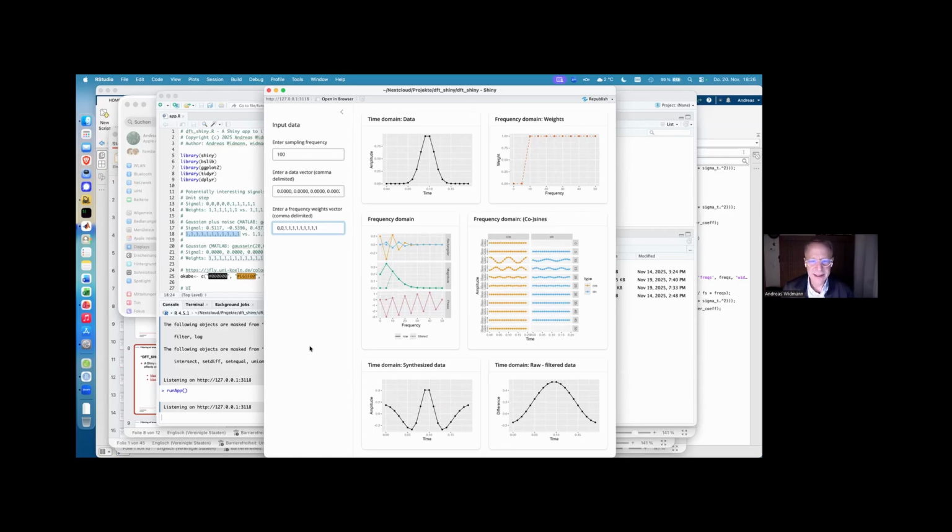It's pretty difficult to make a distinction between a distortion and an artifact in filtering. A distortion is just the effect of the filter that you would accept because you need the filter. The artifact is basically an unintended side effect, but the distinction is pretty tricky. So there's no clear-cut point there, which is what.